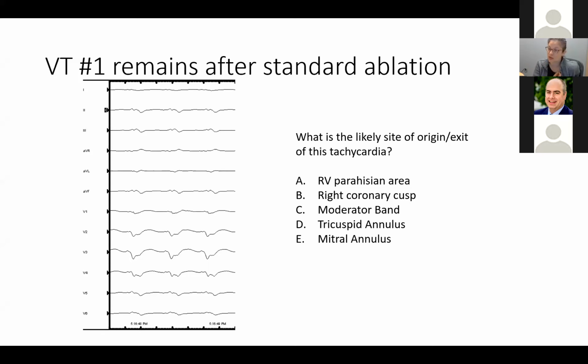Half normal saline, I think, is really useful as well. It gives you a little bit larger lesion formation. It hasn't been investigated prospectively in an image-guided mid-myocardial approach, but that's almost certainly what you're doing if you were to use half normal saline. One of the caveats with half normal saline is just to make sure that you're aware that steam pops can occur with that as well. And maybe Dr. Sauer at some point might want to make a comment about that, because I'm sure that he mentioned it in his talk.